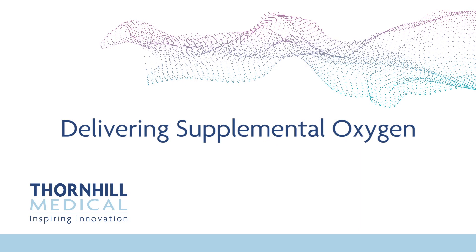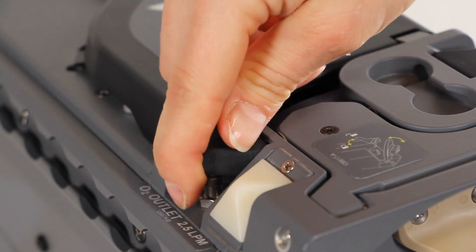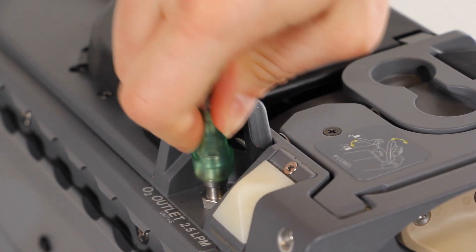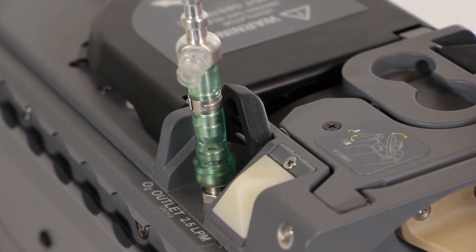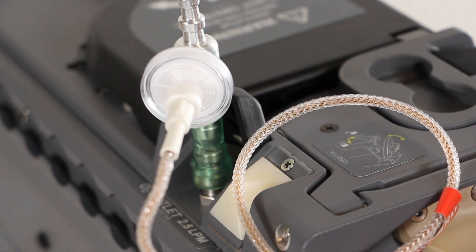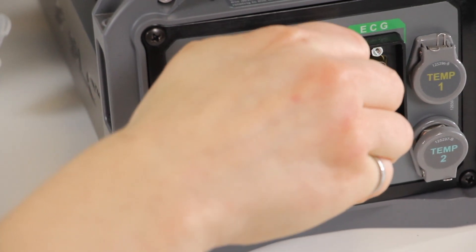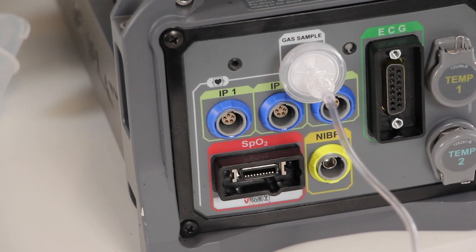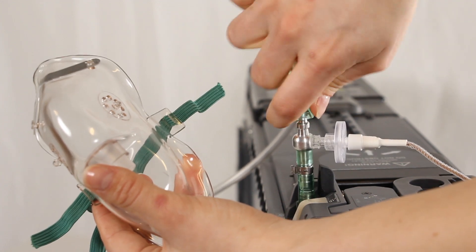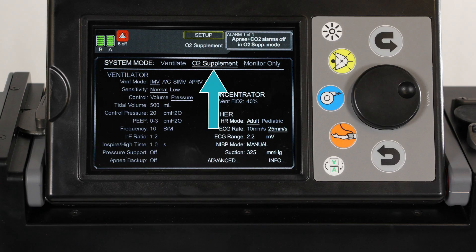Delivering supplemental oxygen. Locate the O2 outlet port on the left side of the MOVES SLC. Open the protective cover of the O2 outlet port by pulling it up. Locate the O2 outlet sampling adapter and connect the green flexible tubing end to the O2 outlet. Attach the sample line filter connected to the Nafion tube to the O2 outlet sampling port on the O2 outlet sampling adapter. Use a butterfly lure connector to connect the sampling line to the Nafion tube. Then connect the sample line filter at the end of the sample line to the gas sample port on the patient connection panel. Attach the O2 mask line or nasal cannula line to the metallic outlet on the O2 outlet sampling adapter. On the setup screen, configure MOVES SLC to operate in O2 supplement mode.